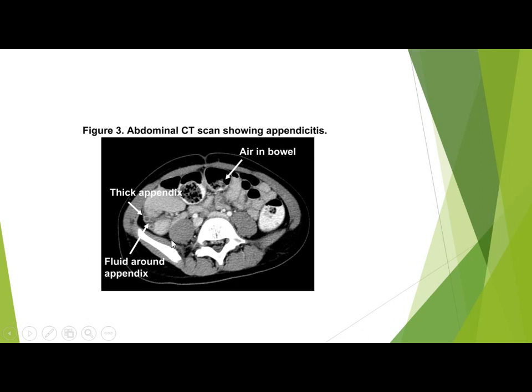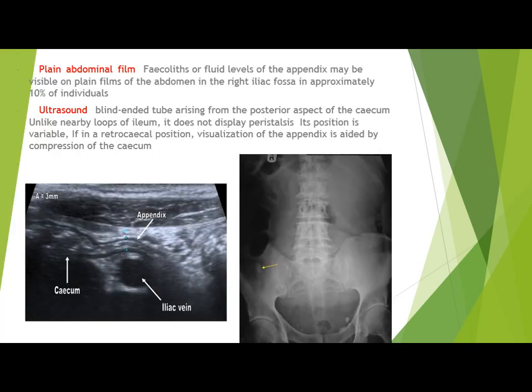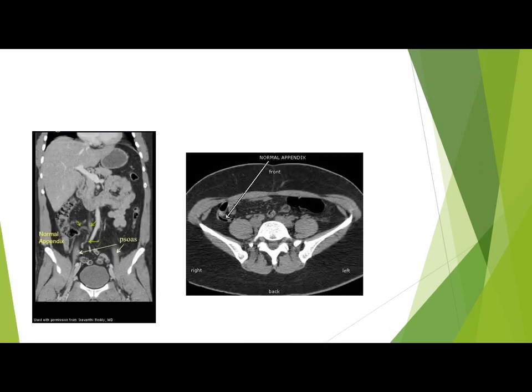So what are the findings of appendicitis, at least on ultrasound? It's a thick-walled appendix, diameter more than 6 millimeters, non-compressible, non-peristaltic. Sometimes there's free fluid or stranding of the fat around the appendix. It's tender at the site, with increased vascularity and surrounding fat planes. You might find some lymph nodes, maybe paralytic ileus around it. You might find some right mesenteric lymph nodes. All of these are findings suggestive of appendicitis, together with lab tests showing elevated white blood cells and things like that.